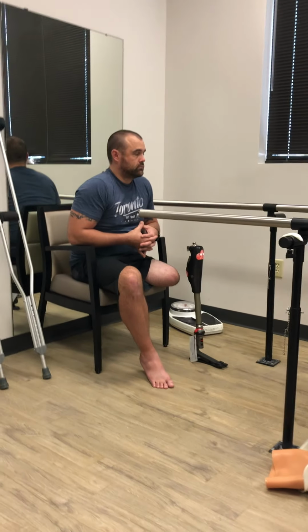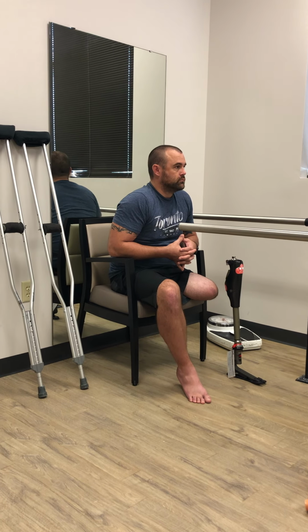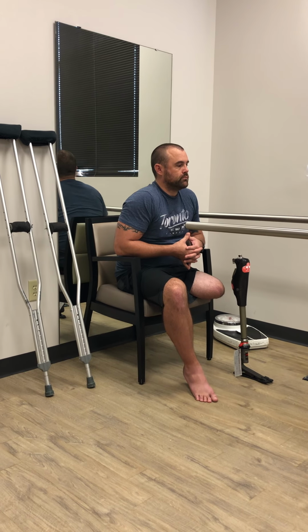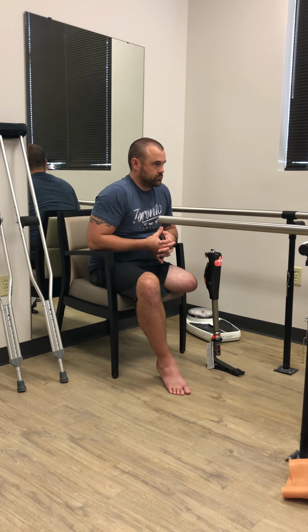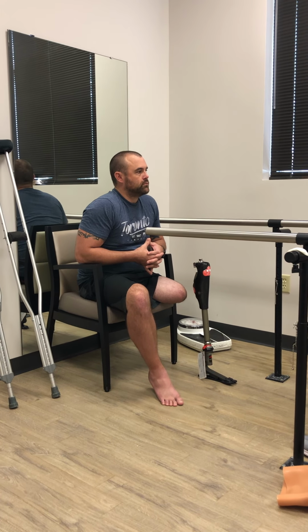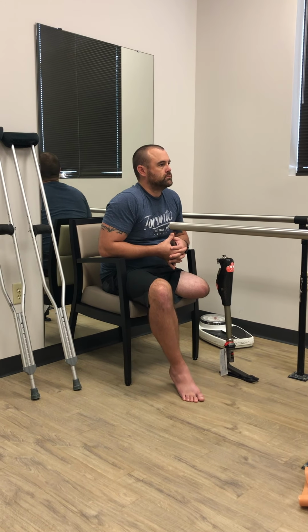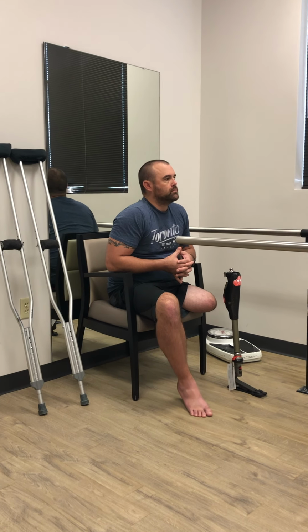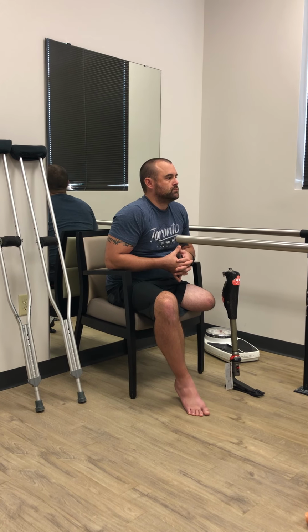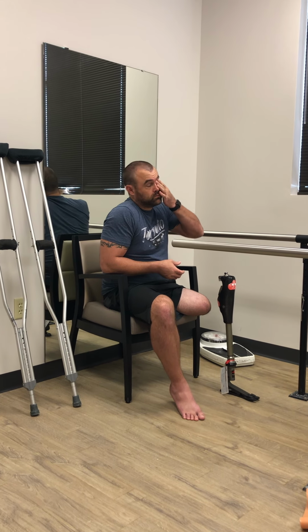So what I always recommend, for 2 reasons, is not just the cushioning in the heel, which you'll come to love. The shoes are also flat, and that is advantageous for the foot. The way these feet work, a 2-part heel, like a cowboy boot, or even some work boots that have a defined heel, and you end up going... and it's hard for me to just make that smooth for you. What you want is more of a rocker bottom. That's gonna come more from a flat shoe. You hit, you roll across, and they're soft, and it'll kind of absorb that dead spot.